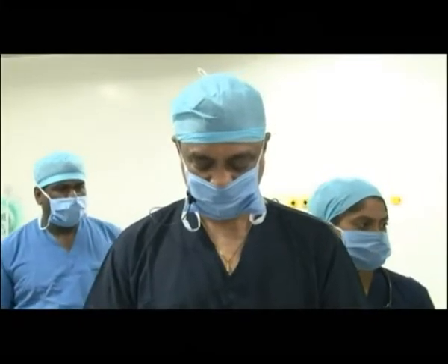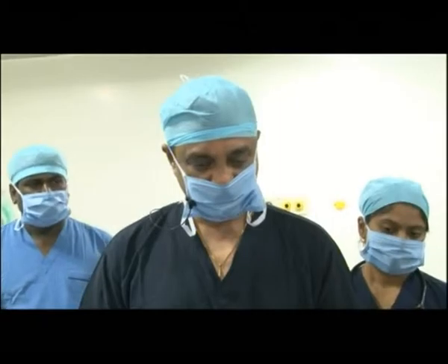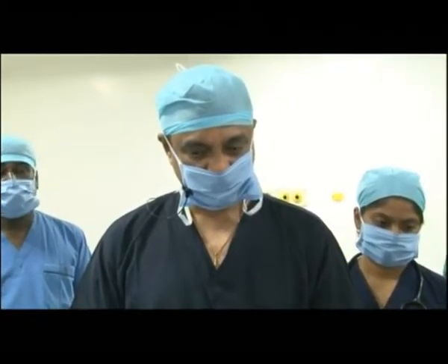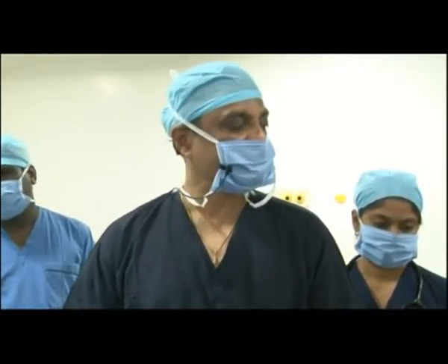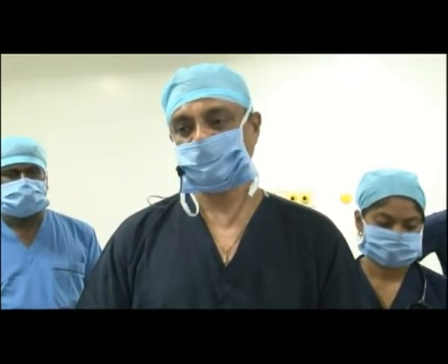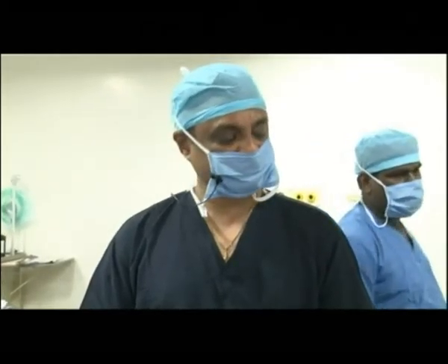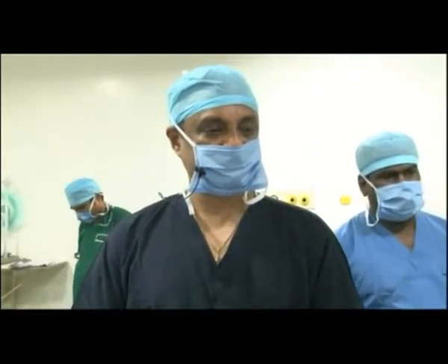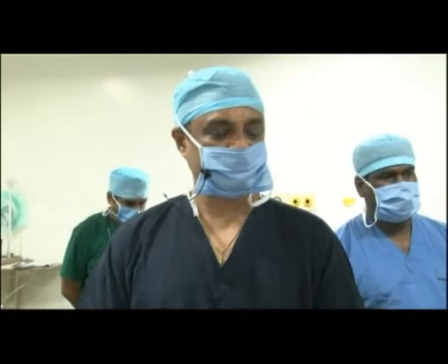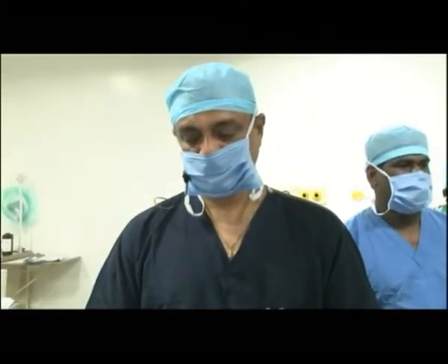The next case, we have a 32-year-old male who has an ulcer in the left foot. He is suffering from type 1 diabetes mellitus and has been on insulin for the past 12 years. His fasting blood sugar today is 401, and this patient is posted for left diabetic foot debridement. The case shall proceed under left adductor canal block and popliteal block under USG guidance, demonstrated by Dr.